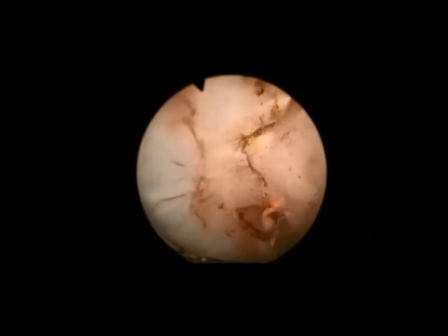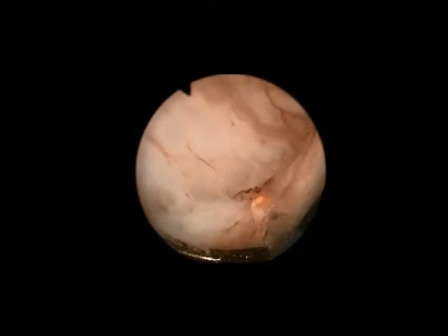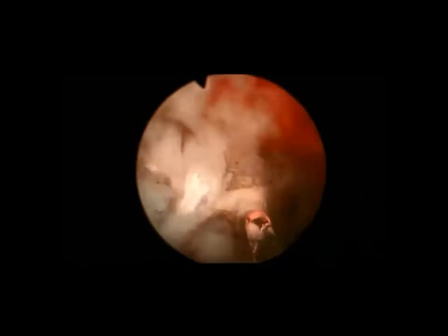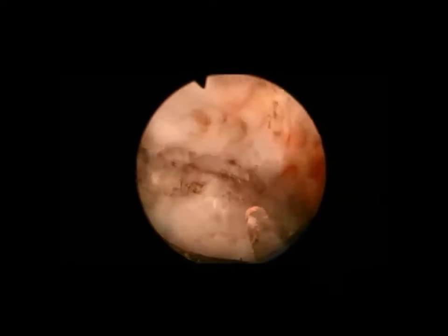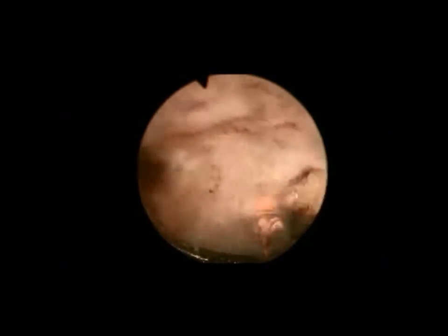Here we are working in the right lateral space, dividing the attachments between the capsule and adenoma, working up on the reflection of the bladder neck. We're now working retrograde, rolling up the apical adenoma, and again going underneath that adenoma and going up the face of the bladder neck. Next, we move to the medial aspect of this right lateral lobe adenoma.